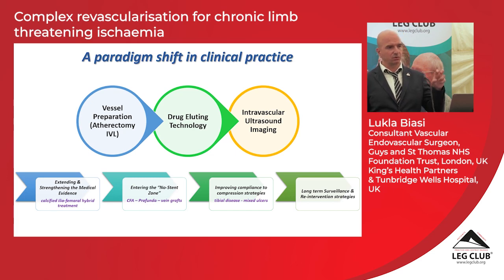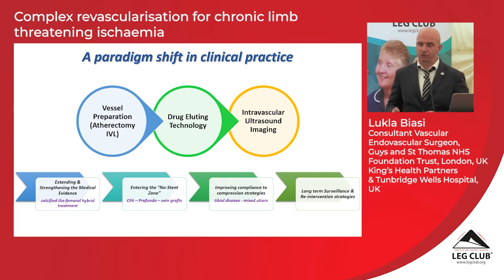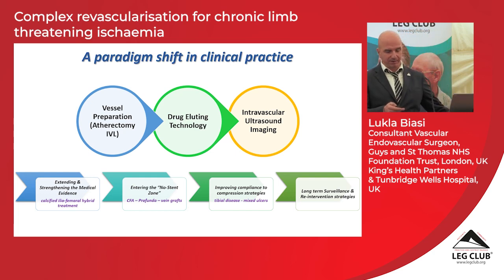And that has allowed us to extend the range of surgery that we are able to do. We can enter the so-called no stent zone. There are areas in the body where stents should not be used at any cost. A stent in the groin is never a good idea, because that may easily block and may reduce the ability of going back with bypass surgery. We can push with the new stents, but believe me, it's not a very good idea. Yes, so I'll probably skip other images, but I will limit it to a couple of slides more.